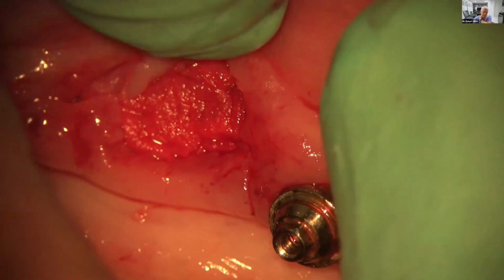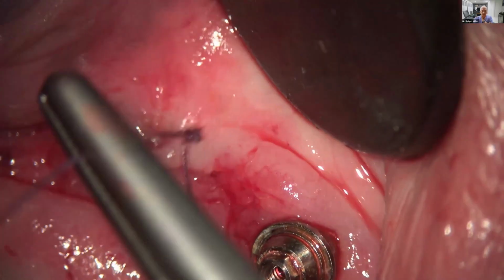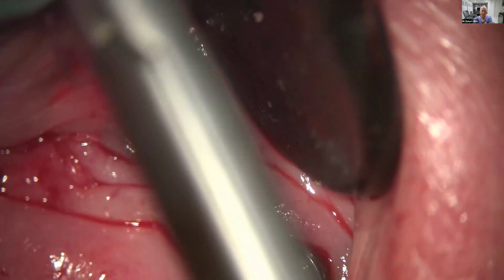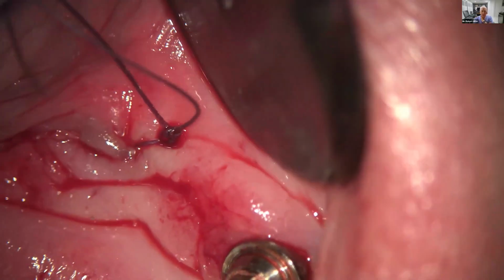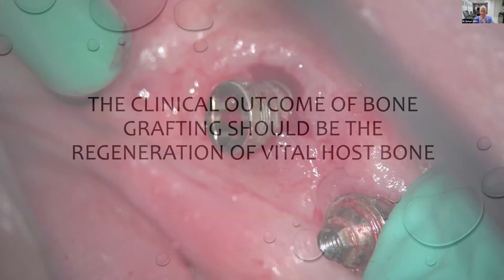All right, now just take your suture material, and I use a combination of mattress and interrupted suture. Here's a mattress suture. Look at the beautiful closure I get with a single mattress suture. And then two more interrupted on the two ends there. And then this case will heal in the end.